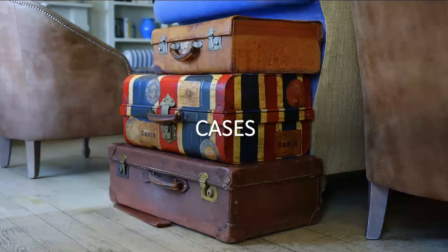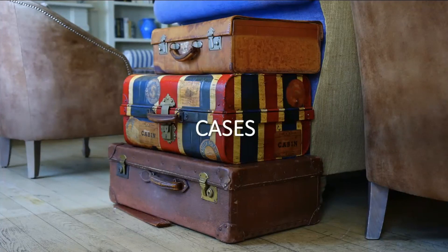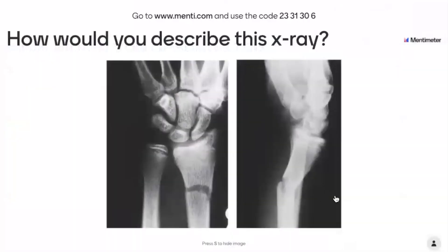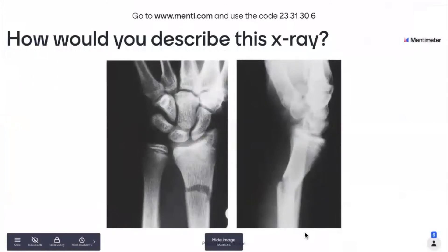We've got a couple of cases, and using Menti I'm going to give you the opportunity to practise describing the x-rays. It doesn't need to be perfect — I'm not asking for radiology consultant level terminology — but it'd be really great if, in the chat or in Menti, you can describe what you see. How would you describe this x-ray? I'll leave the image on the screen for a minute. Whatever works for you — take a bit of paper and have a think about how you would describe this x-ray.